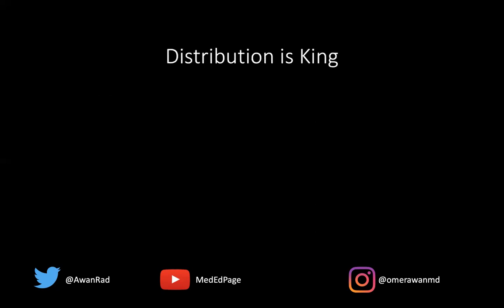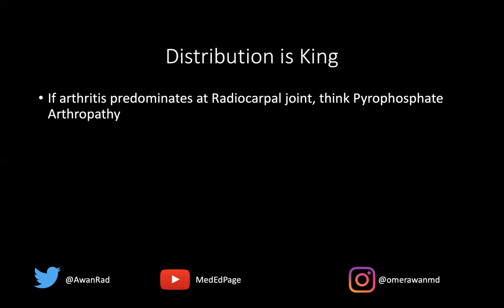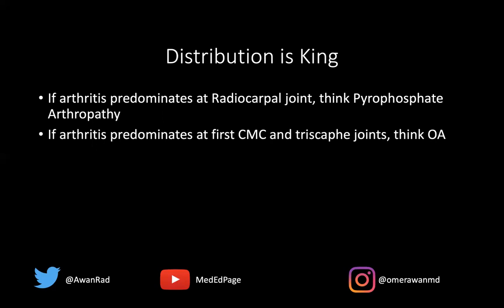Whenever you have an arthritis case, the distribution is always key. In our case, because the degenerative changes of subchondral sclerosis, joint space loss, osteophytes, and subchondral cystic change predominate at the radiocarpal joint, this is pyrophosphate arthropathy. DJD or osteoarthritis would be very unusual at the radiocarpal joint unless it's a secondary cause like post-traumatic osteoarthritis. If the arthritis predominates in the first CMC and triscaphy joints, the answer is osteoarthritis, even if chondrocalcinosis is present in the TFCC or lunotriquetral ligament, because chondrocalcinosis can occur in osteoarthritis.